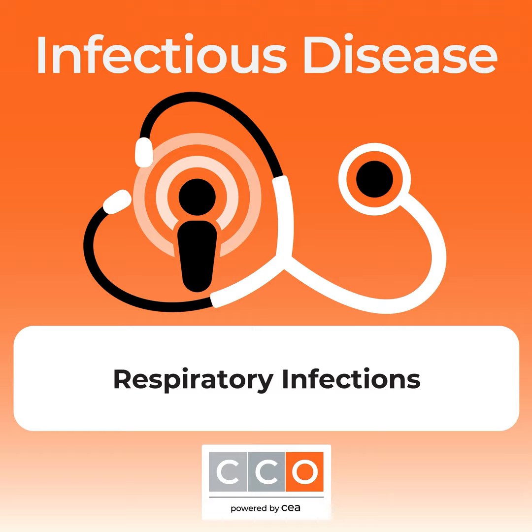And it did this in almost 1,200 hospitalized adults with suspected pneumonia. It did it using sputum, tracheal aspirates, or BALs. And other tests, like maybe nares swabs for MRSA PCR or urine Legionella antigen, was all at the discretion of the clinical team. And there was antimicrobial stewardship that was there, and they received results for both arms from 8 a.m. to 5 p.m. Monday to Friday, and they had standardized recommendations based on the results. And the primary outcome for this study was time to first antibiotic modification, so either escalation or de-escalation within 96 hours.